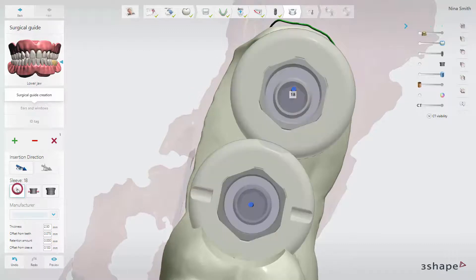To add the marks on the support sleeves, click the orientation marks button while creating the surgical guide.